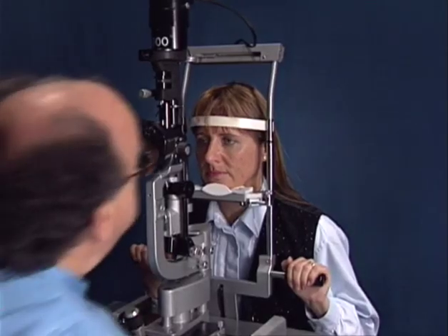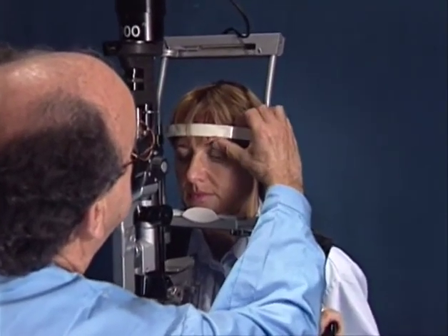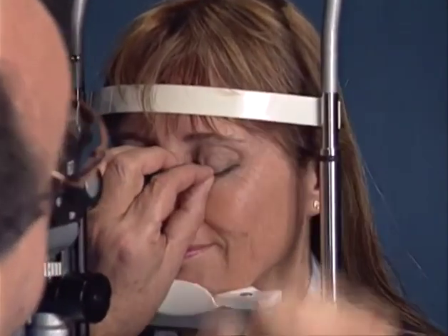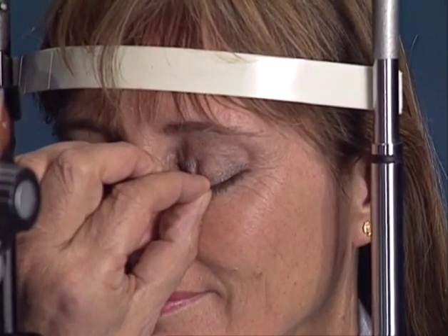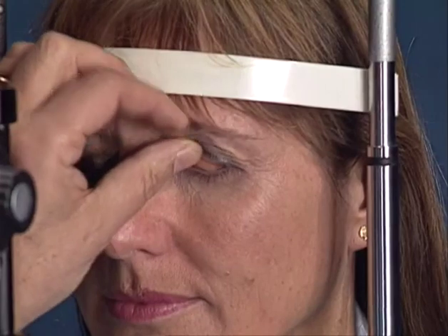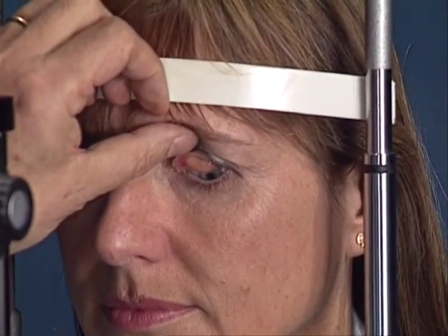So the patient is asked to look downwards. The lid is slightly lifted so that the cilia can be grasped with two fingers. The lid is pulled downwards until the skin fold produced by the superior border of the tarsus is visible. The lid skin above the hinge line is immobilized. The tarsus is rotated and held back with the thumb pushing the cilia against the upper lid skin.